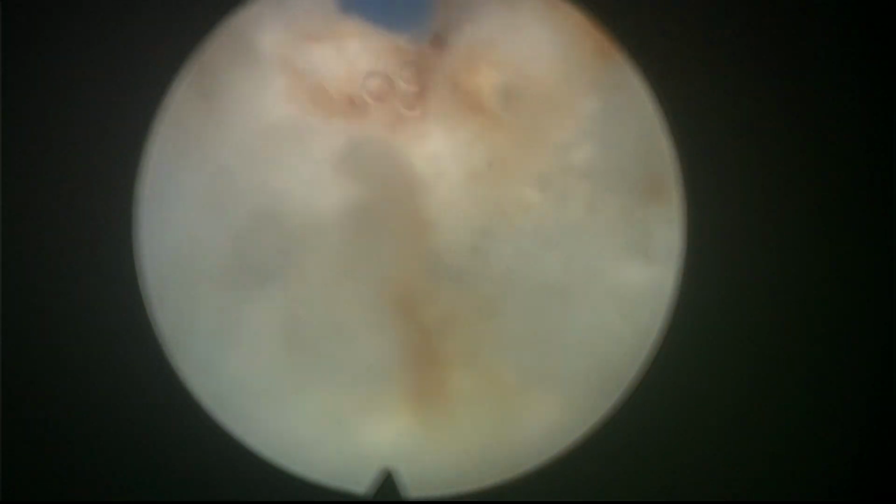My favorite cases are the redo cases. This is where I have more fun, because it's always a little bit of a challenge. Sometimes the effects of the previous treatment on the tissue are quite marked. Sometimes, the plane is not ideal.